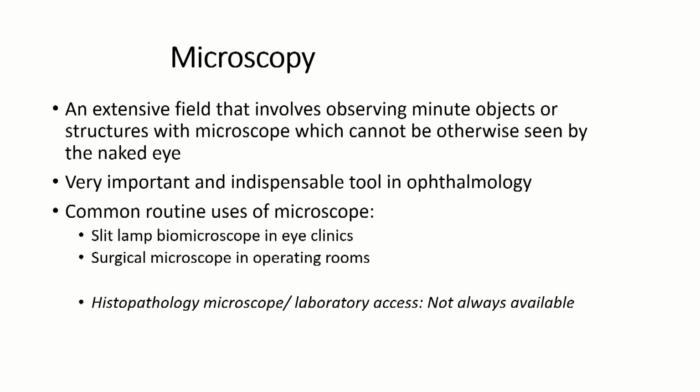Microscopy, on the other hand, is an extensive field that involves observing minute objects or structures with a microscope which cannot be otherwise seen by the naked eye. It is a very important and indispensable tool in ophthalmology. The common routine use of microscope includes slit lamp biomicroscope in eye clinics and surgical microscope in the operating rooms. The other type of microscope is a histopathology microscope, which needs laboratory access, which may not always be available, especially in resource limited settings.